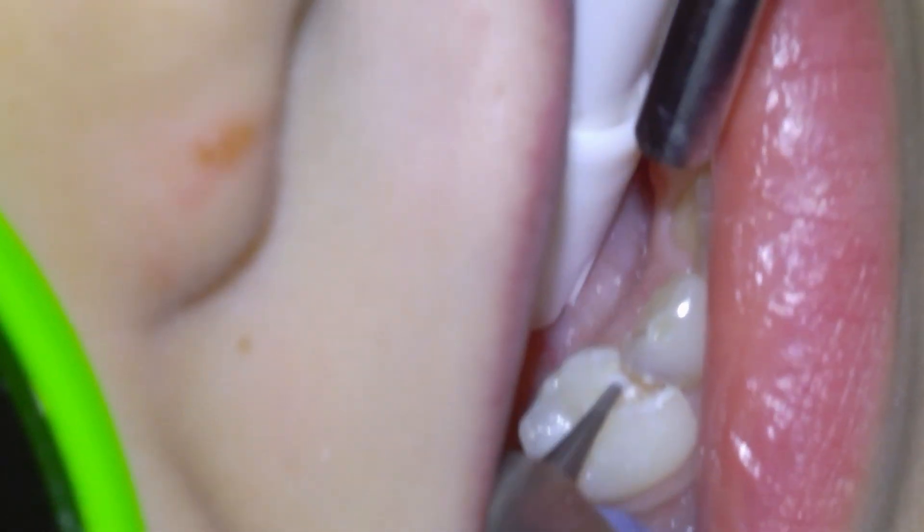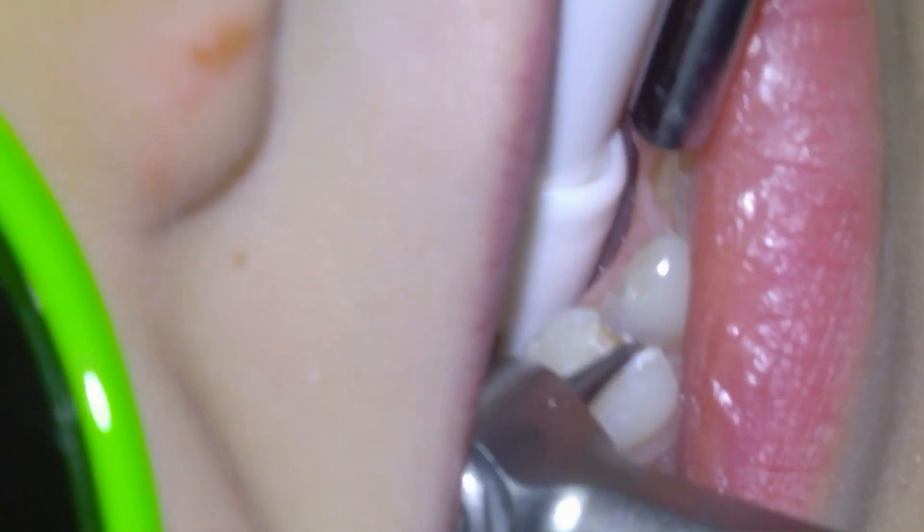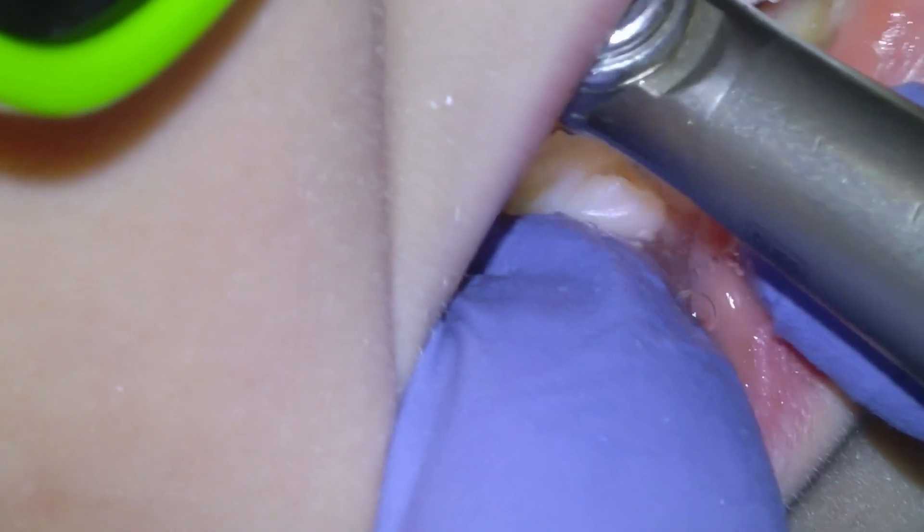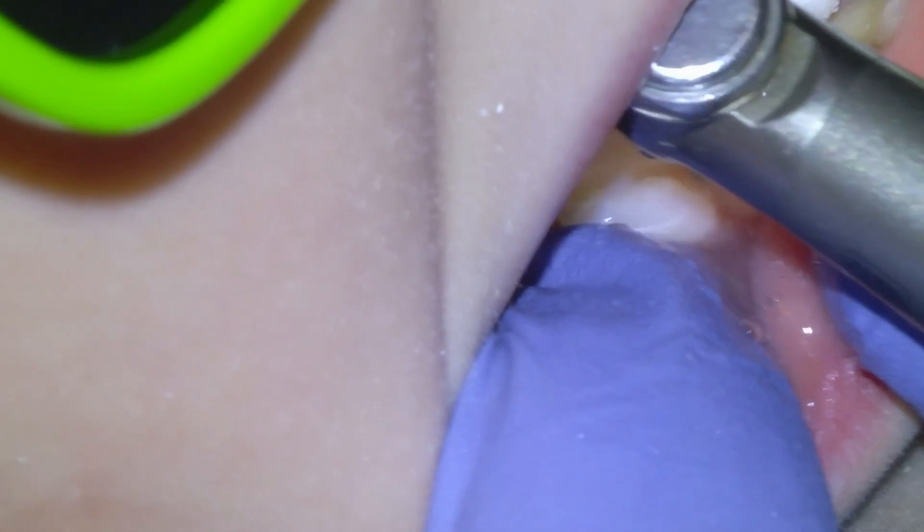Pediatric teeth are always a little bit more technically challenging to work on because of the smaller size and the behavior management component, but this patient did great. You can open up the buccal contact with a carbide flame.